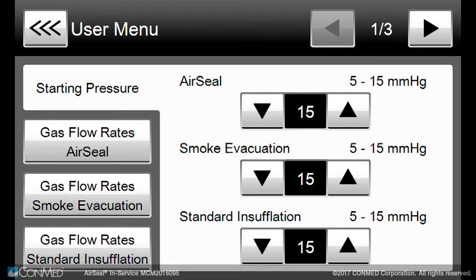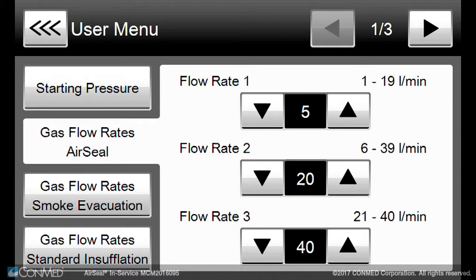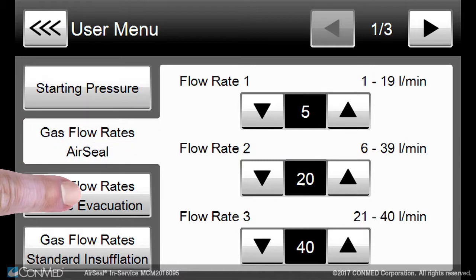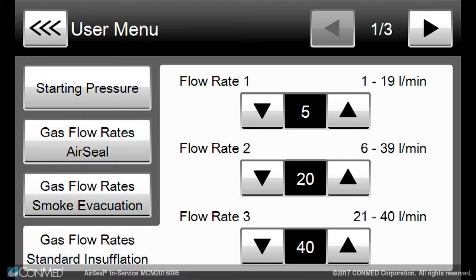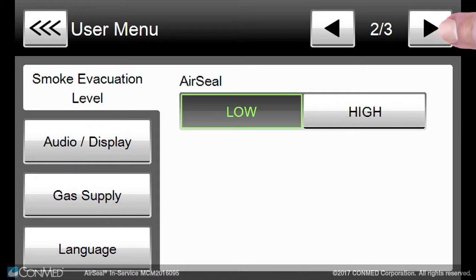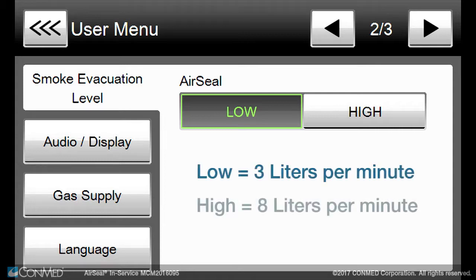You will be able to set the starting pressures and gas flow rates for the air seal, smoke evacuation, and standard insufflation modes. You can preset the smoke evacuation level for the air seal mode, where low is 3 liters per minute and high is 8 liters per minute.